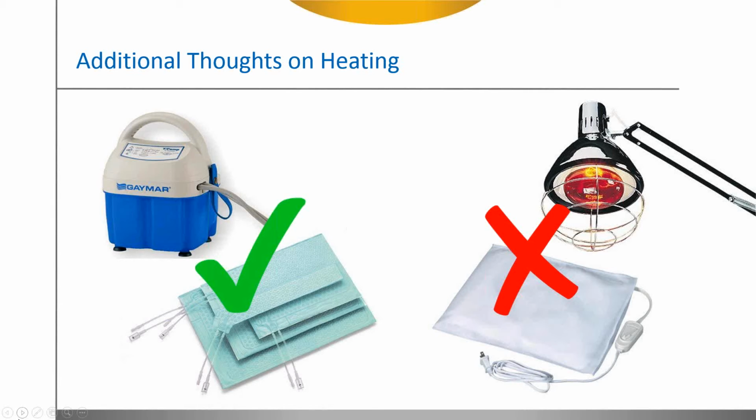I've seen it in many labs going around the country. Water-based equipment is much better for PV. It injects less noise into the PV system, and is also proven to be safer when it comes to pad-associated skin burns and maybe dehydration of your animal while doing the PV work.